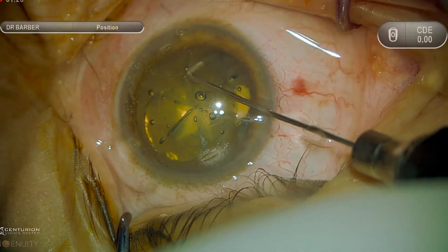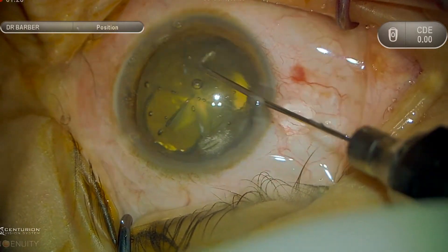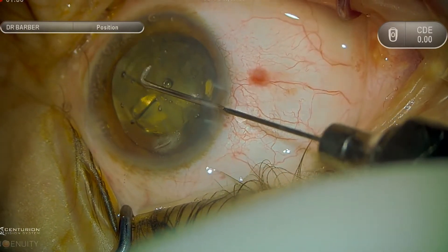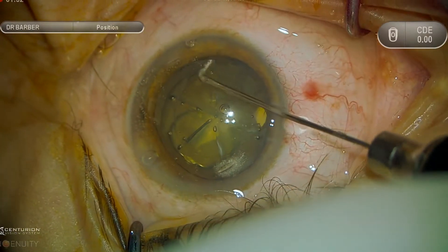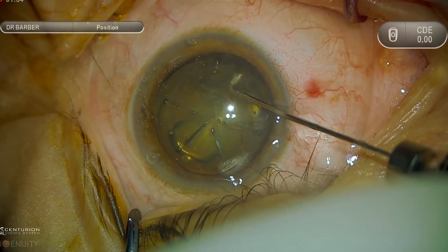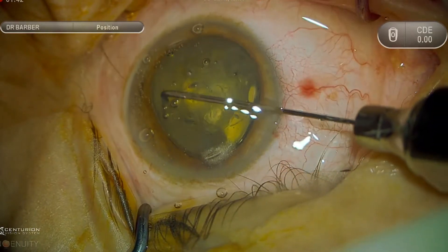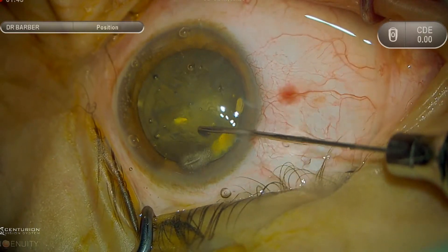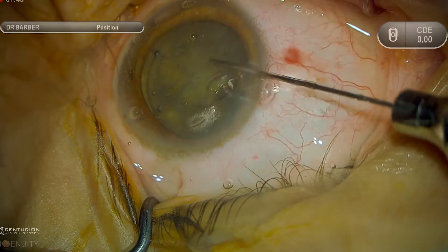What makes this case interesting is the dense asteroid hyalosis, which can obstruct the surgeon's view and dampen the red reflex, which will be demonstrated here momentarily.